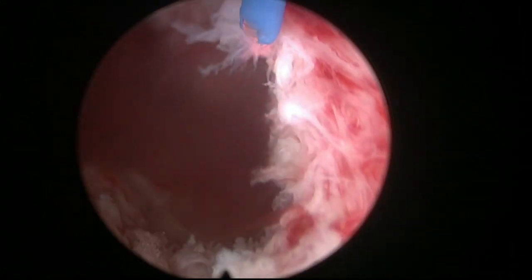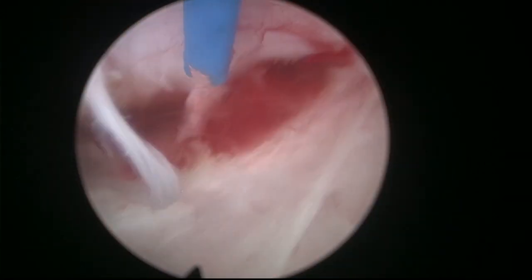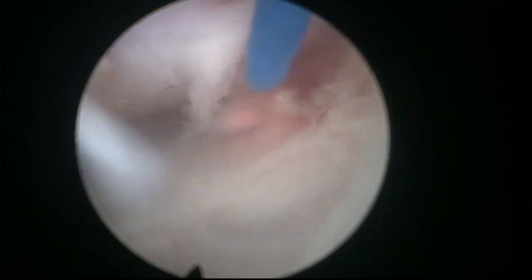And here you can see the white line. We developed the posterior space, and you can see now that the apex has been liberated. There's some bleeding coming from here. Let's see if we can stop that.